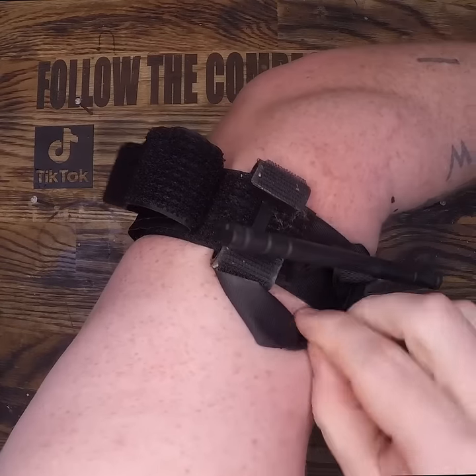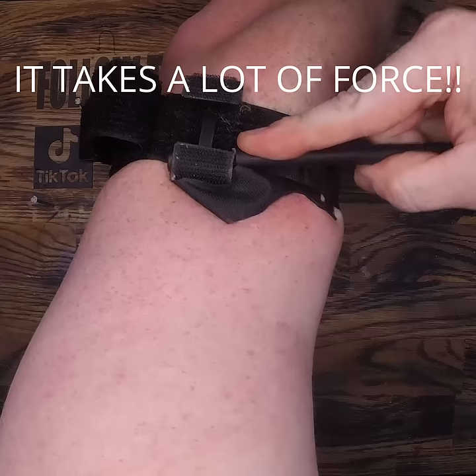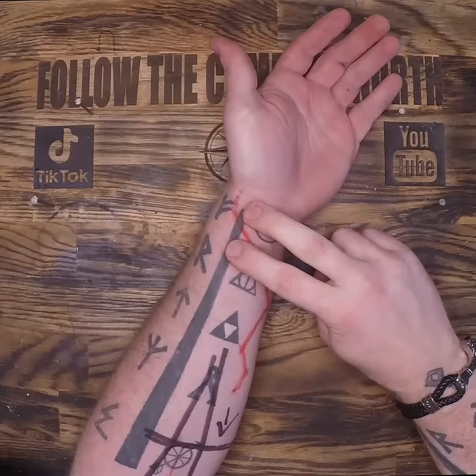Get it as tight as possible with that first wrap. Tuck away this retention band so that you can get this into the clip first try. Then you can pull that back out and secure it permanently so it does not undo itself when caught in clothing.